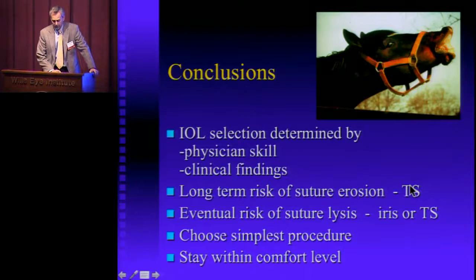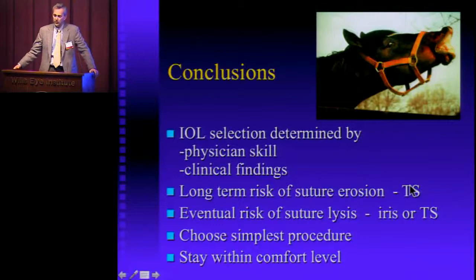And the clinical findings, the long-term risk of suture erosion and the eventual risk of suture lysis ought to drive what we do. And certainly the age of the patient makes a difference. I might do some things in an 80-year-old that I probably wouldn't do in a 20-year-old. Most importantly, stay within the comfort level.